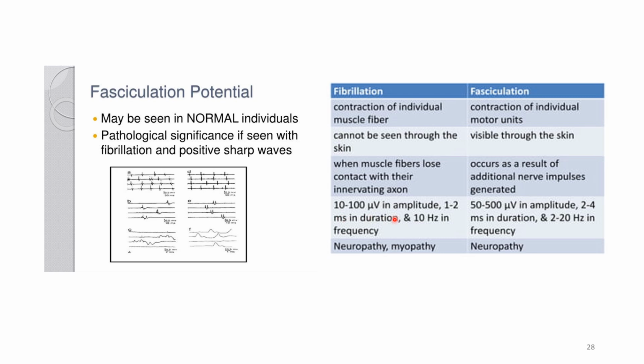And see the amplitude, 10 to 100 microvolts, very small, and 1 to 2 milliseconds in duration, very small, and 10 hertz in frequency. So all things are low.